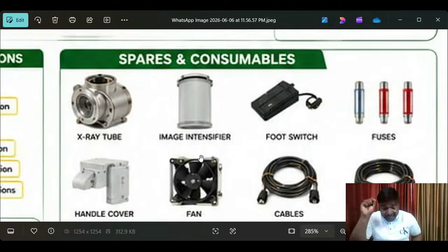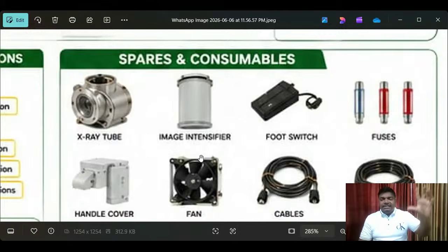You have to ask immediately. They may say it is not exposing, then you have to focus there. Or the locking system is not working properly. Next, not able to see the live image on the monitor. They will give complaints like these only. For that purpose, if you know all these things, then you can analyze by yourself before attending the call. Then you can catch the problems and give proactive performance.